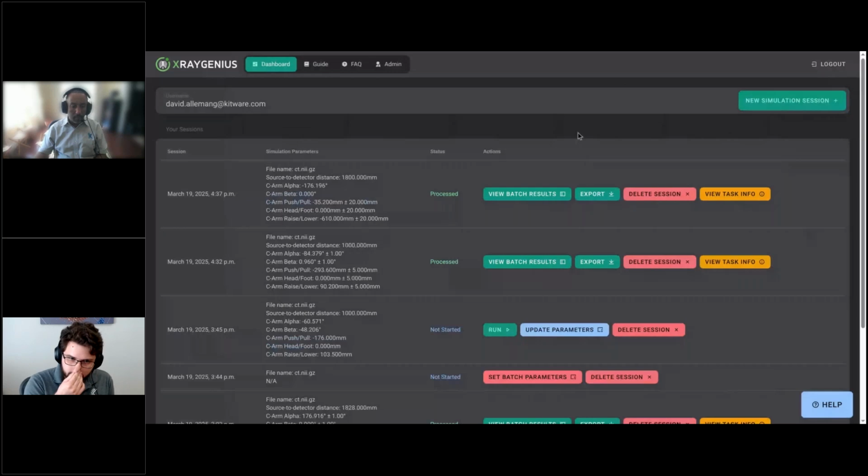Those are the two sample cases that I wanted to look at. I think they illustrate the broad capabilities. If people have specific questions, I'm happy to address that, or demo it. So there's a question that came in.